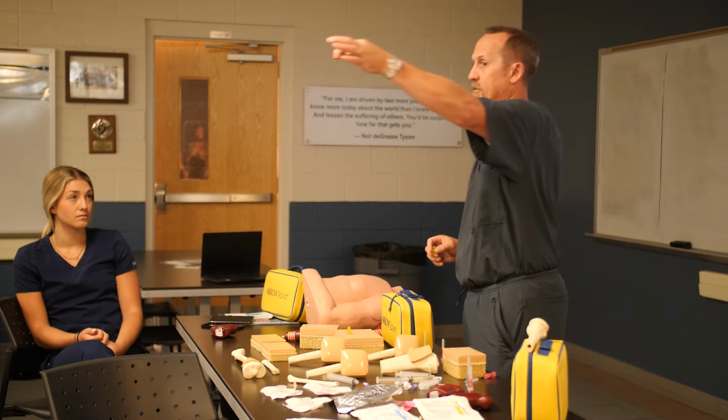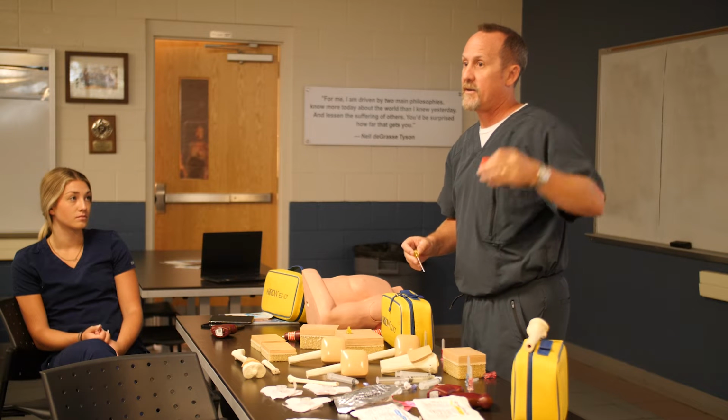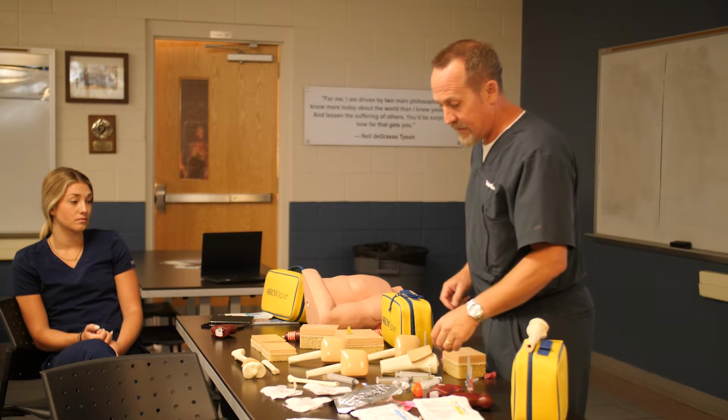All of your kits have a little sharps lock in there. It's great for you guys in the field. You stick it in there, it doesn't come out, it can get kicked across the room. Nobody's gonna get poked. We put the stylet in there.